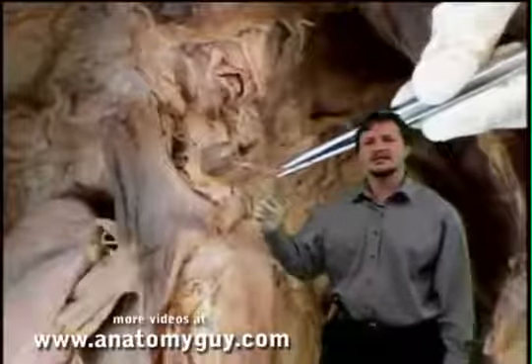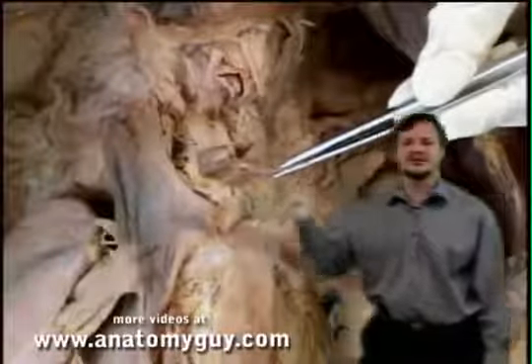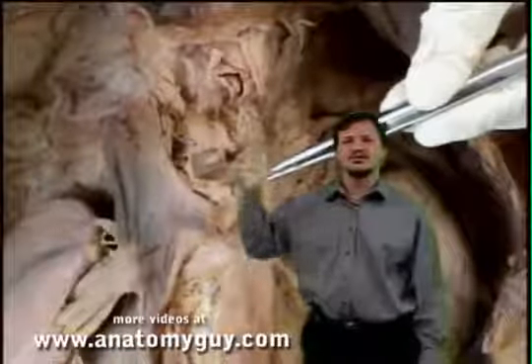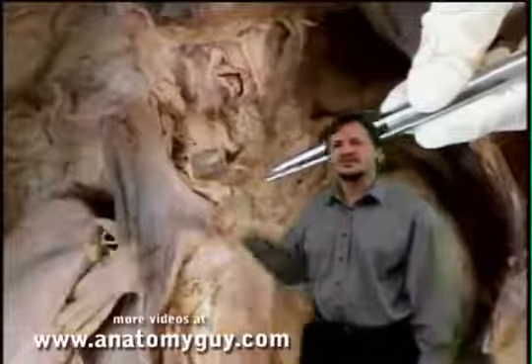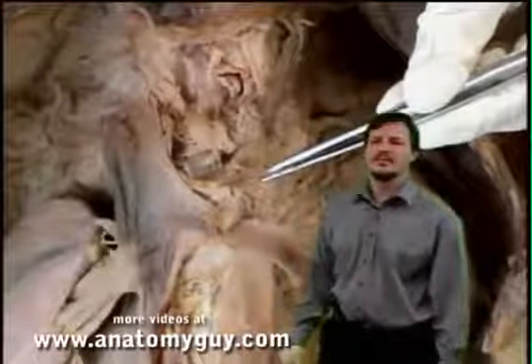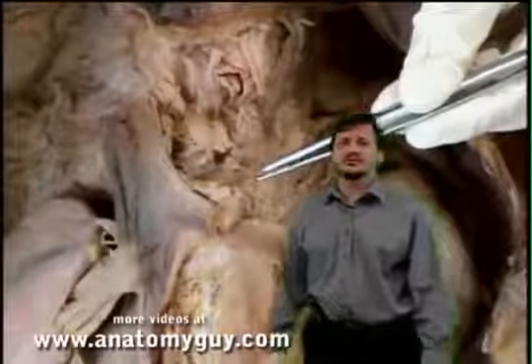The celiac, as we can see here, has 3 major components to it. There's the branch that will run to the left, the splenic. There's a branch that will run superiorly, the left gastric. And there's a branch right here that will run to the right, which would be the common hepatic. And those will supply all of the foregut and foregut-associated organs.